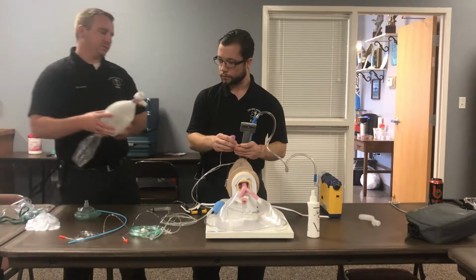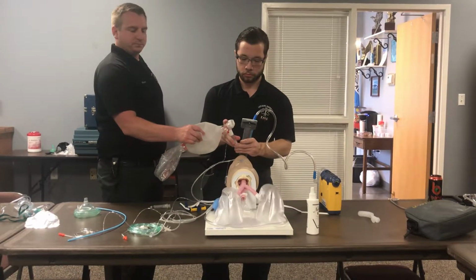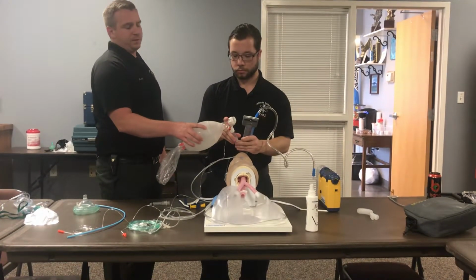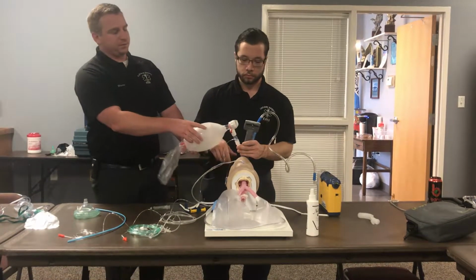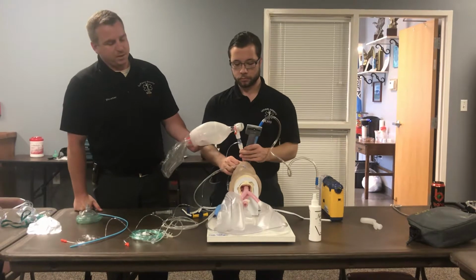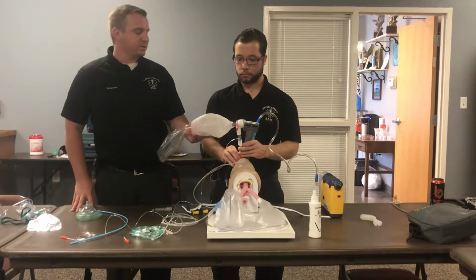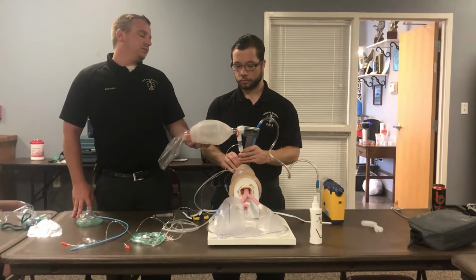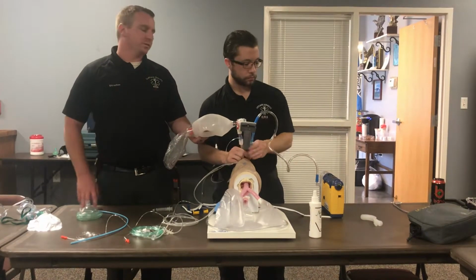Alright, so he's passed it through the cords. Now we're going to begin our confirmation processes. Obviously, capnography and end tidal are most important. Also, absent epigastric sounds, positive breath sounds, misting in the tube. The biggest indicator was that we saw it pass through the cords.